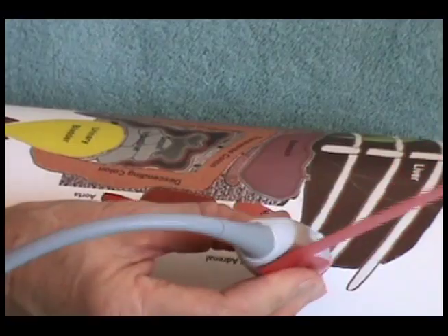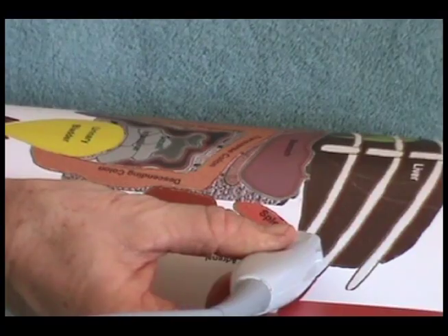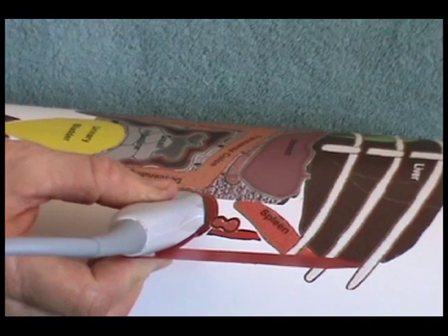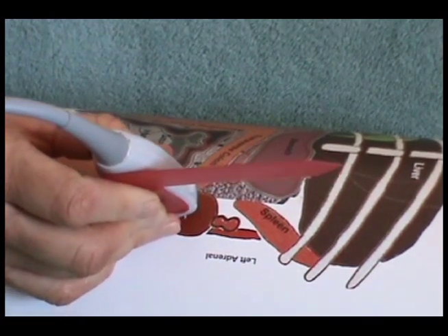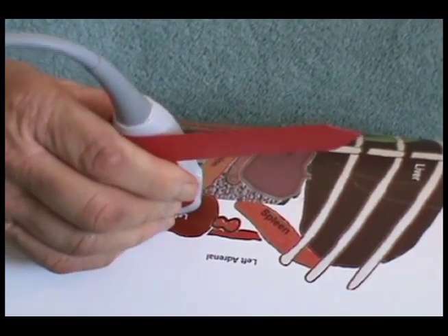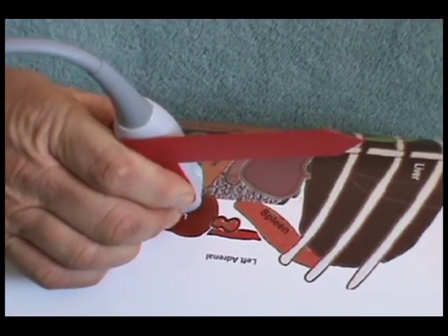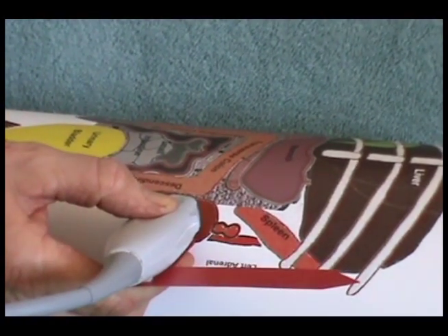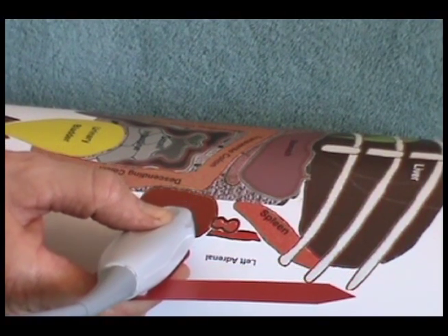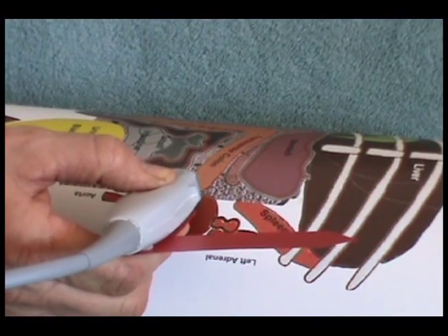Rotate the transducer to a left lateral sagittal position and slide caudal to the last rib. To bisect the kidney, the transducer should be perpendicular to the patient's body and parallel to the tabletop or the floor. My abdominal graphic does not simulate this position well, so I will compensate to obtain the proper transducer position. Slide the transducer slightly dorsally or ventrally to center the kidney under the transducer.